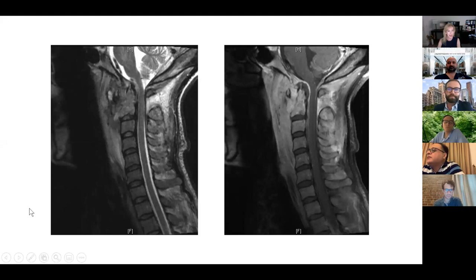Okay. So you have your sagittal T2, and I can't use my mouse, but up at the C2 level, you have abnormal signal within the bone marrow there. So increased T2 signal. You also have a lot of soft tissue in front of C2, between C2 and C1, predental space. On your post-contrast image, avid enhancement. The body itself, you can't tell as much, but it is abnormal, C2, and then that enhancing soft tissue where you're pointing, and then in front of that too, a lot of prevertebral soft tissue enhancement. It doesn't look like any cord enhancement or any epidural on this slice, but maybe a little collection there too.